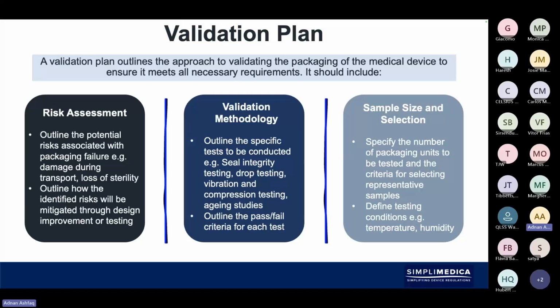That could then lead to bacterial infection in a patient, which could ultimately lead to death in some cases if the infection is serious, especially with things like implants, where you've got biological materials being protected in packaging, where sterility is such a high factor and the integrity is so critical. Any breach of that barrier could then lead to bacteria being spread within the implant, which could then be transferred to the patient and could cause severe, catastrophic issues within the patient.